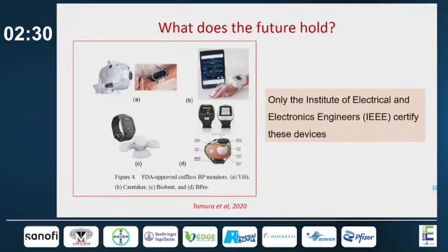What does the future hold? The FDA approved cuffless blood pressure measuring devices. They have not yet been clinically validated, but they are approved by the Institute of Electrical and Electronics Engineers, waiting for studies of these devices.